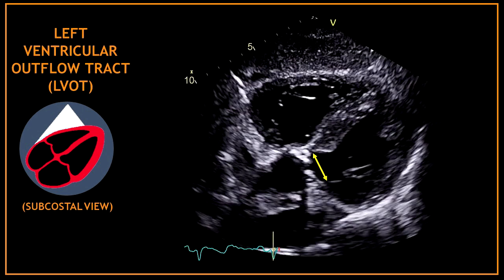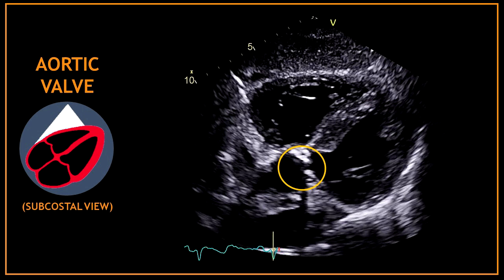If you tilt the probe you can also open the aorta. Once again you can notice that this looks like a horizontal apical five-chamber view. By doing this, you can now visualize the left ventricular outflow tract and you will also be able to assess the aortic valve.